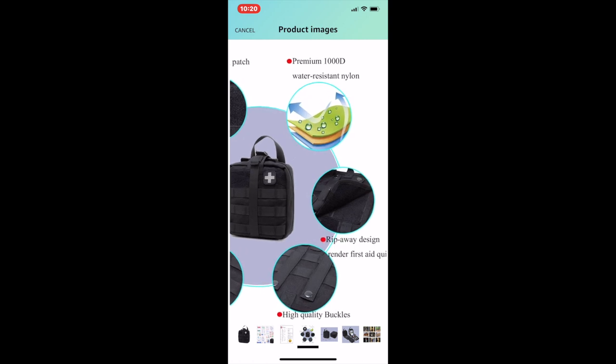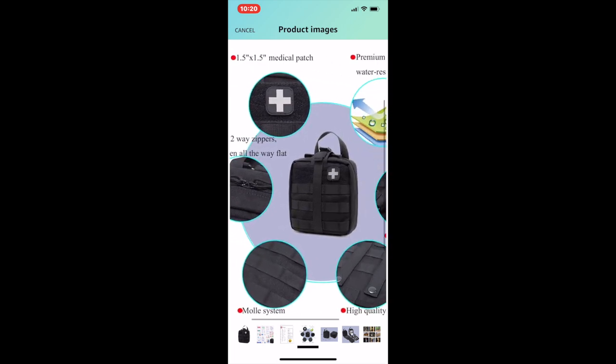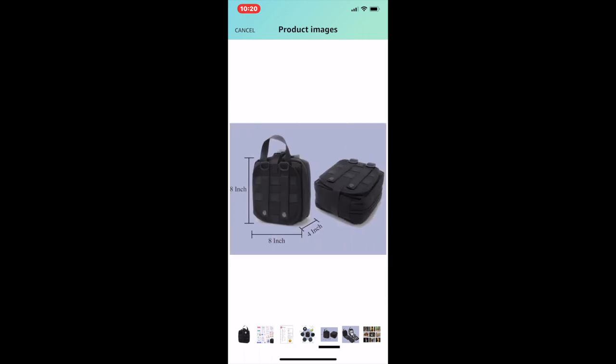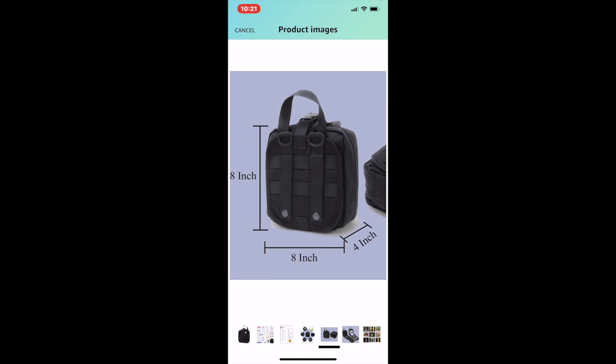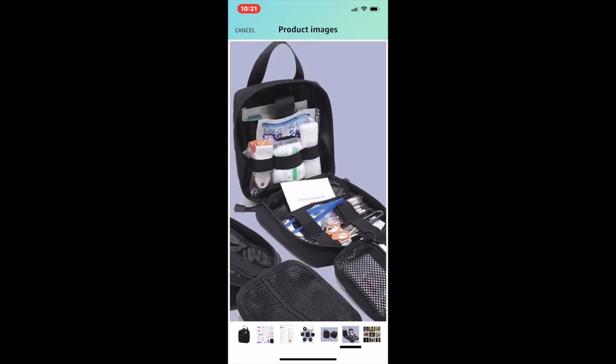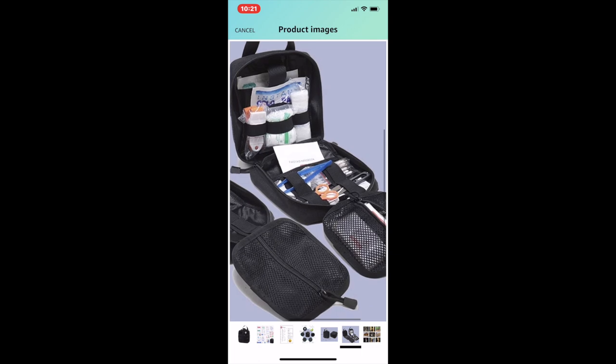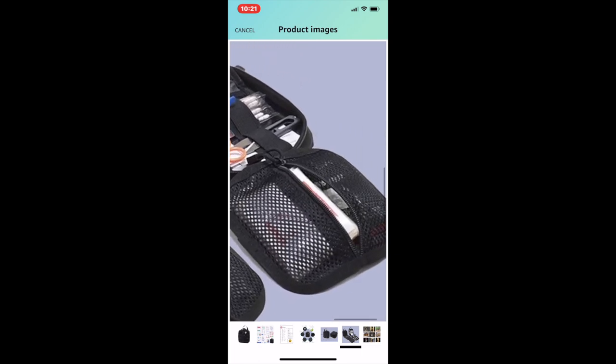The material is water-resistant nylon with high-quality buckles along with the medical patch. These are the dimensions of the bag — check it out to get better insight on how big it'll be on your belt, or check out my battle belt video. Here's how they have the items organized in the bag — bandages up top, and a breathable zippered area for adhesives.